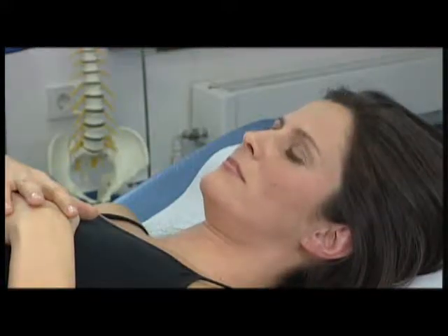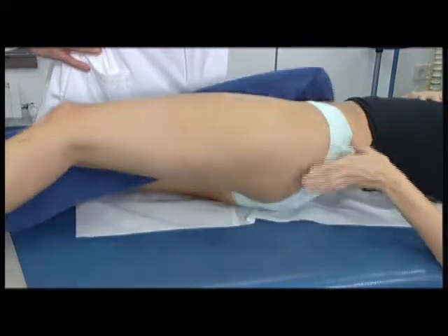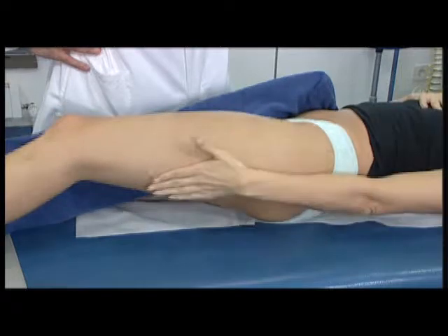The doctor asks the patient to describe the painful spots, which may even cause referred pain in the knee. Und dann auch hier im Gesäß und zieht runter bis ins Bein.